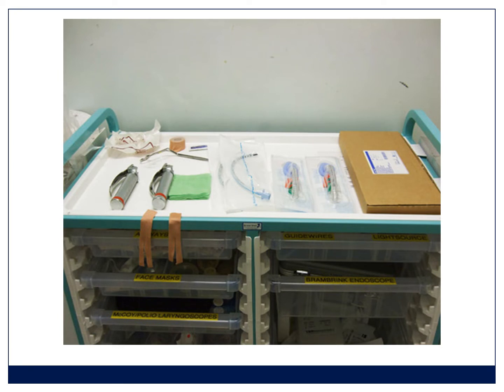You have to get to know the airway trolley. And again, it's ideal if there's an expert in your theatre or in your hospital that is checking these things. But you need to be able to do that yourself to a degree as well. You need to make sure that you've got a working laryngoscope, ideally 2. You need different size endotracheal tubes, Guedel airways, and in particular, especially in an obstetric theatre, you need a supraglottic airway device, a ProSeal or an iGel ideally, probably a size 3, or an LMA if you must, but it's better to use a 2nd generation.